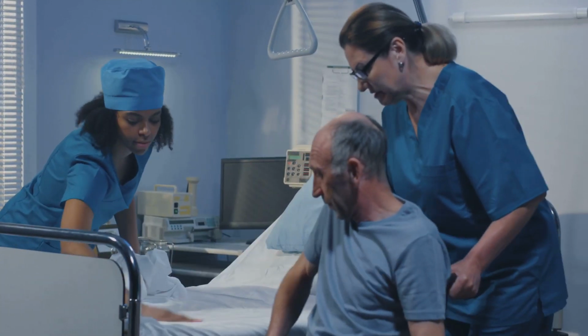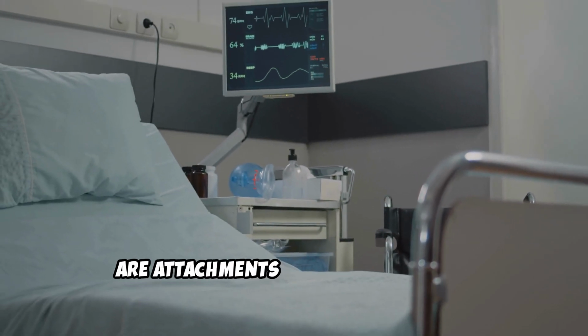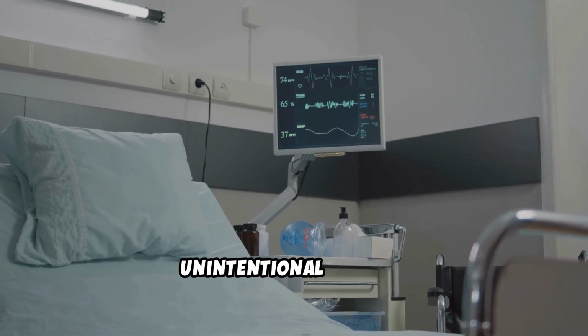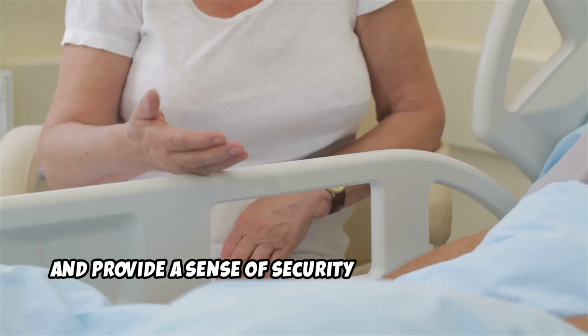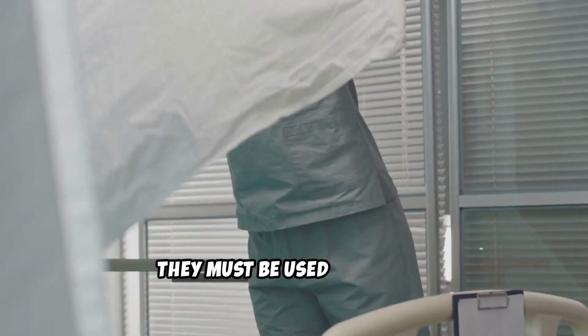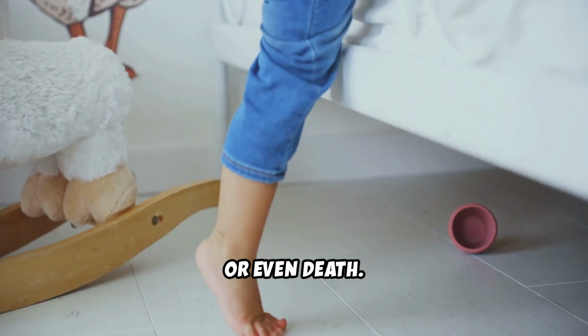Let's break it down. Bed rails, also called side rails or safety rails, are attachments used on hospital or long-term care beds to prevent falls or unintentional rolling, assist with turning or repositioning, and provide a sense of security for some patients. But while bed rails can be helpful, they must be used correctly. Improper use can lead to entrapment, injury, or even death.